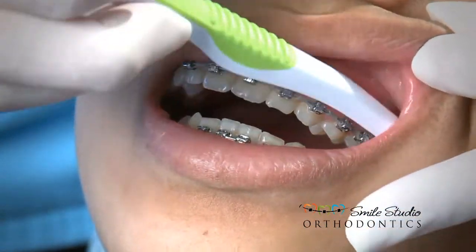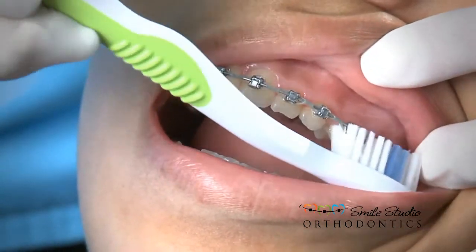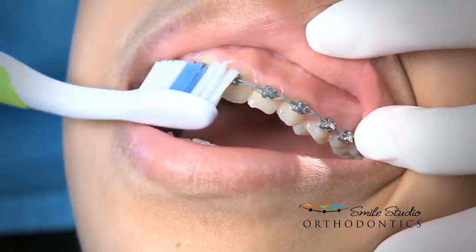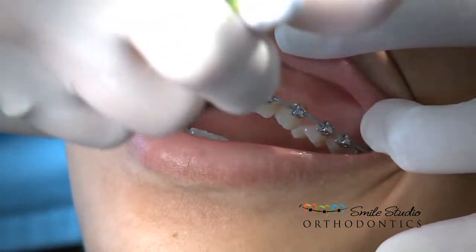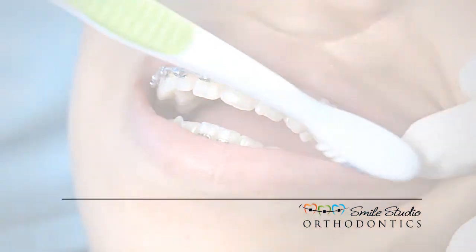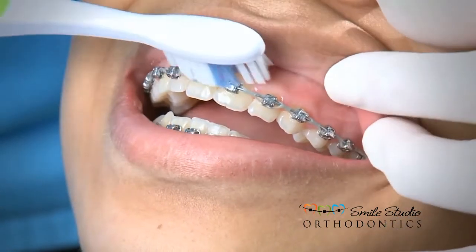Next, brush up underneath the braces, again putting just enough pressure on the brush to get the tips of the bristles under the wire. Brush from one side to the other several times before you move on to the next angle. And lastly, brush directly on top of the braces and wire, repeating this same motion several times. Remember to gently brush the gum line too. That's where your teeth and gums meet. And doing that will help keep those gums from getting swollen during treatment.